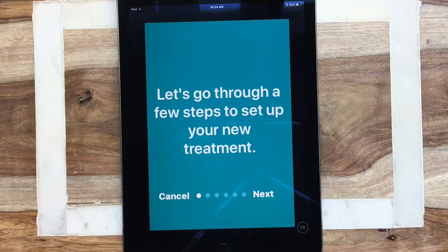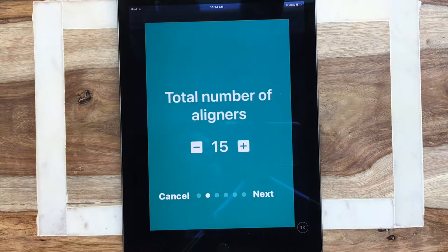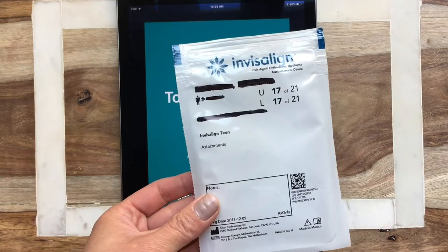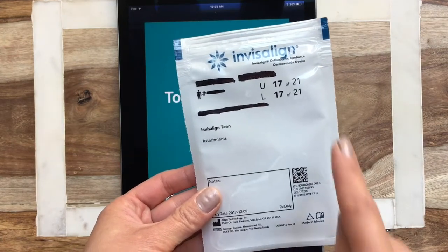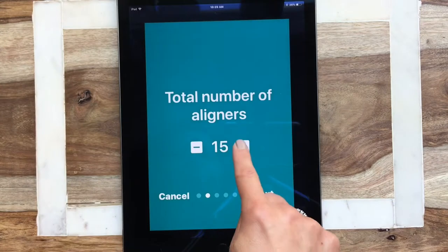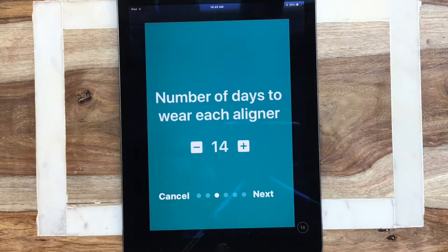When you first open the app it's going to ask you to set up a few parameters, so let's go ahead and get started. The first setting is total number of aligners — this will be the total number of aligners you have in your entire treatment. If you're not sure, you can look at your bag. For instance, for this Invisalign patient there's a total of 21 aligners, so go ahead and move it to 21 and hit next.